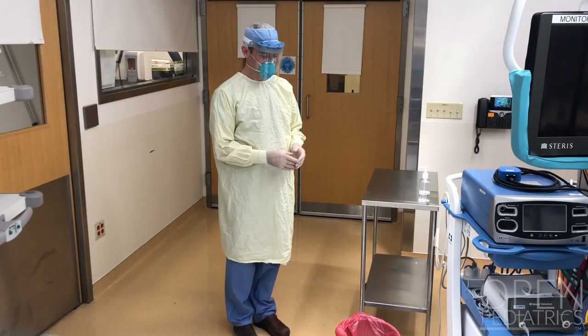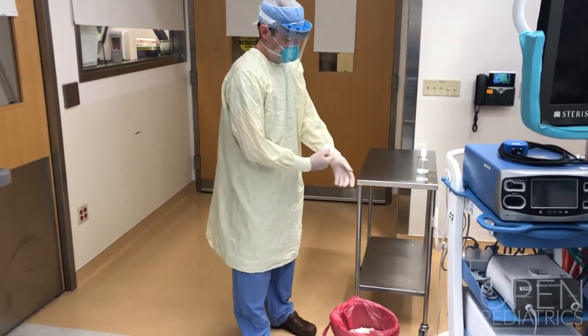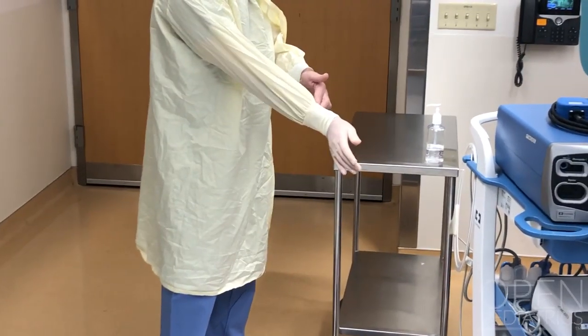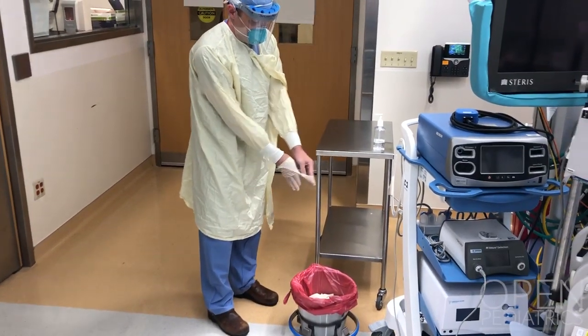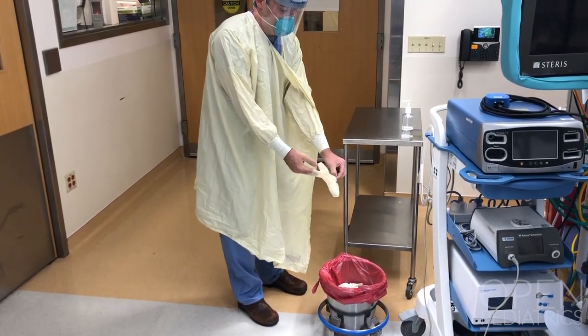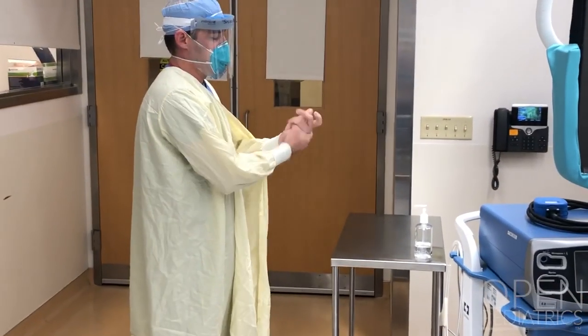A doffing station should be set up by the exit door of the operating room — the one that leads into the hallway. To doff your PPE, start by removing your first glove, keeping in mind the outer part of the glove is dirty. Touch dirty to dirty, then slowly and carefully slip your fingers under the cuff of the second glove and carefully remove the glove, taking care not to snap it. Keep your hands away from your face while removing your gloves to avoid any potential contamination.